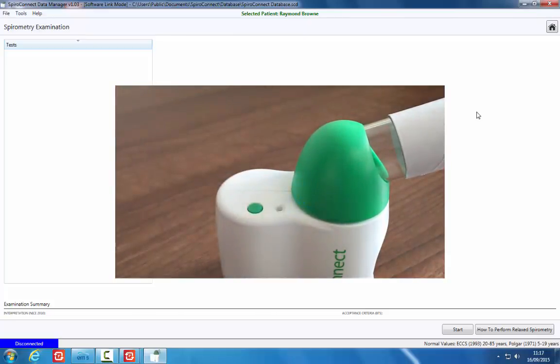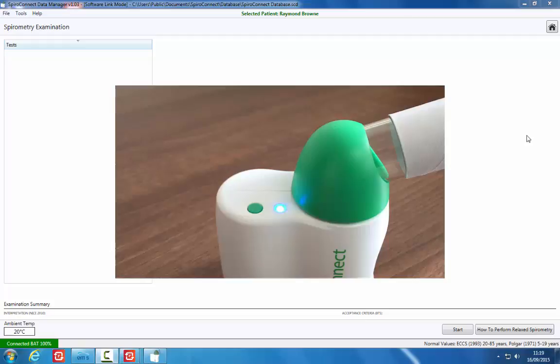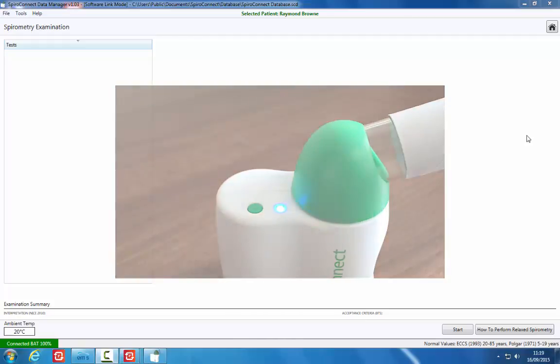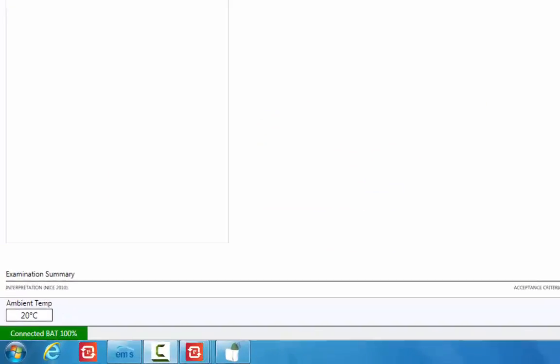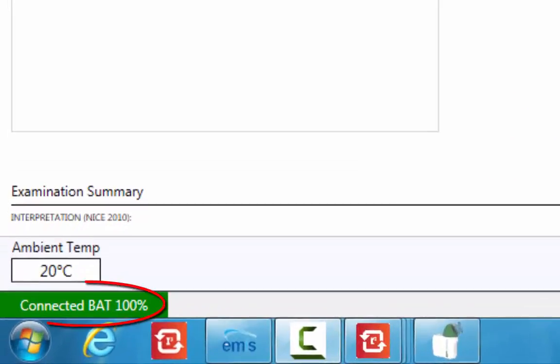A rapid flashing blue light will indicate the device is attempting to connect to the software. The light will go solid when connected, and the software will show 'Connected' in the bottom left corner. Also shown is the battery level.